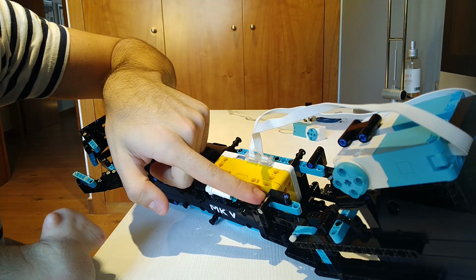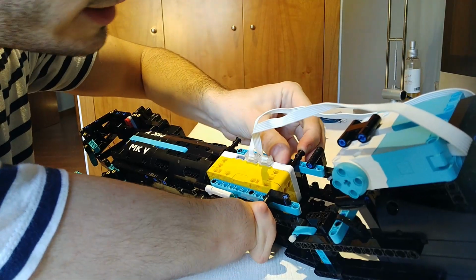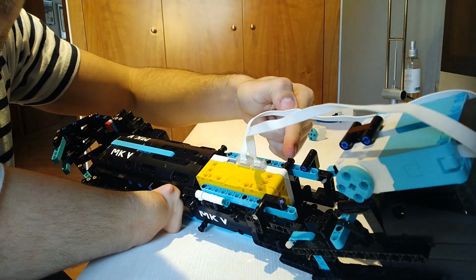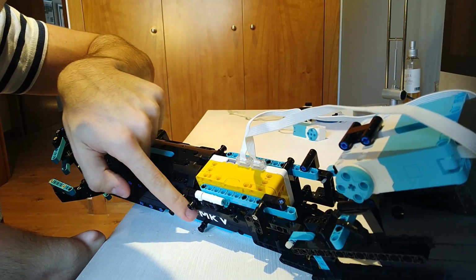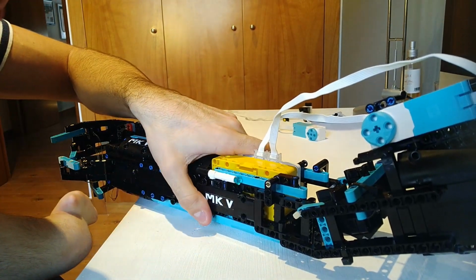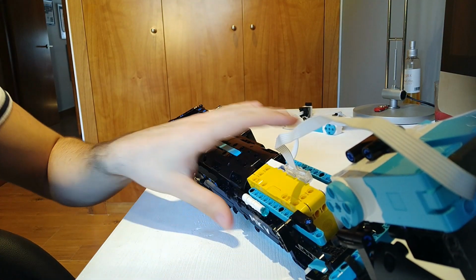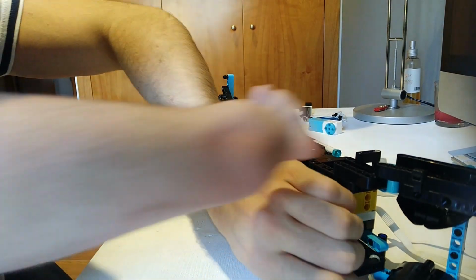Once you connected this pin right here to the hub, you can actually pull the other pins inside so the hub stays in place. There's two right here, one is here, the other one is here. And you can actually see right here there's other pins that need to go inside. So the hub is fixed to the prosthetic and it actually gets a lot of resistance to the prosthetic. Once we're done connecting the hub to the prosthetic, we need to turn the prosthetic all the way over and remove this part.